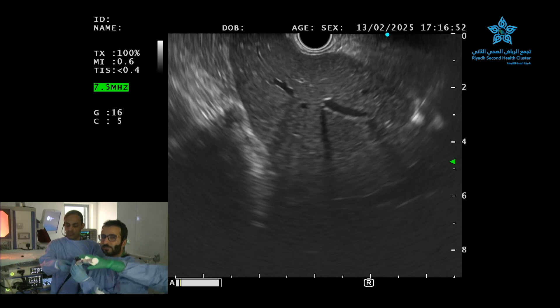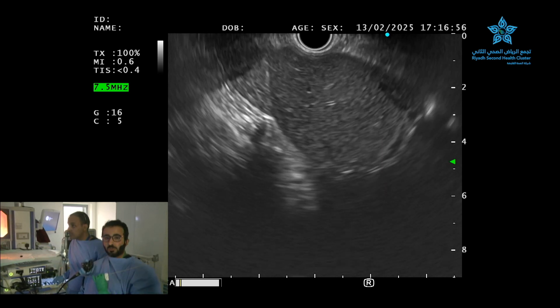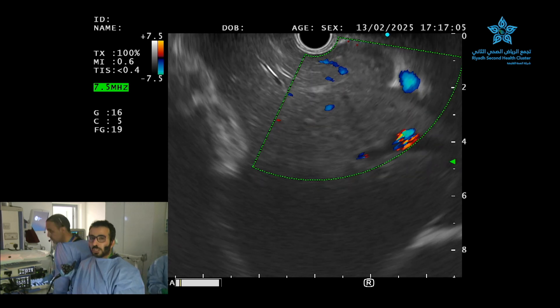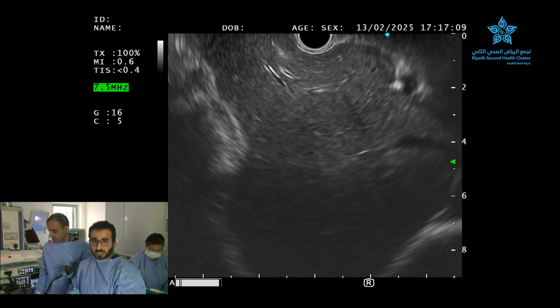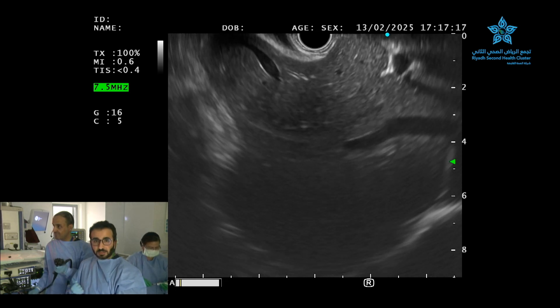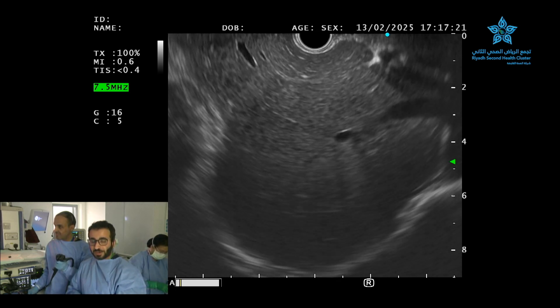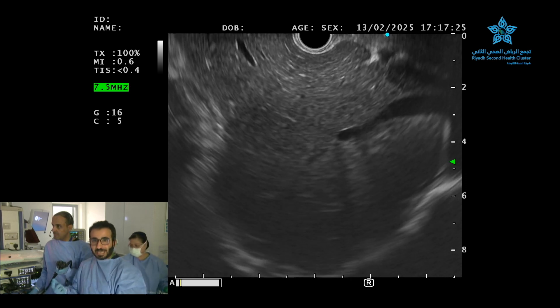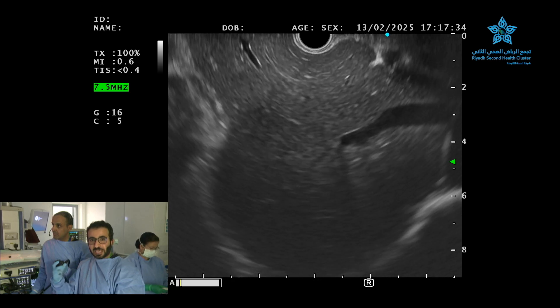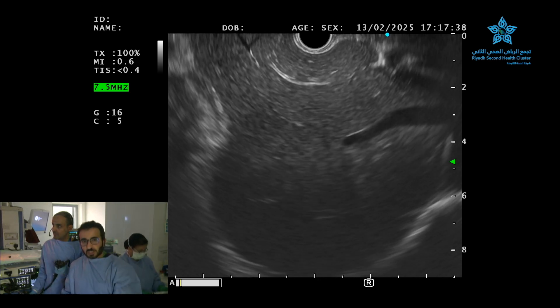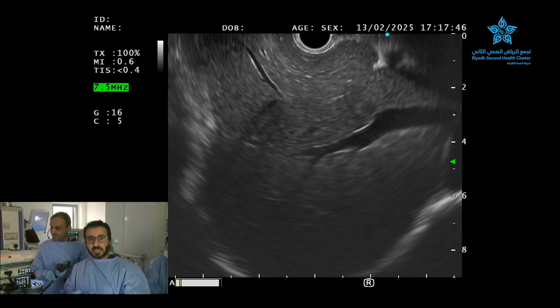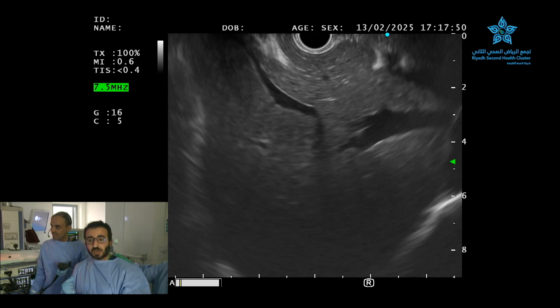Before going live, before introducing the needle into the scope channel, we flush the needle with one cc of heparin until we see a drip coming out from the needle. Then we hook the needle to the negative pressure syringe which has two cc of heparin — that is the wet heparin suction technique. We do three actuations, one pass, at least two to three centimeters into the liver parenchyma. Then we close the suction port before getting the needle out, and push the sample into formalin using the remaining one cc of heparin drawn initially before the procedure.